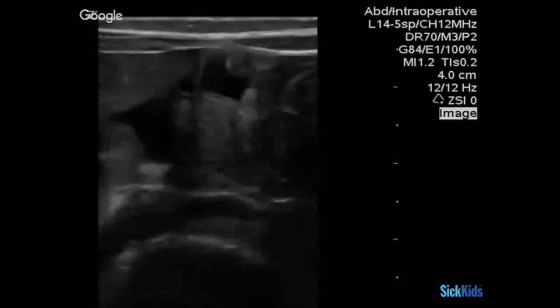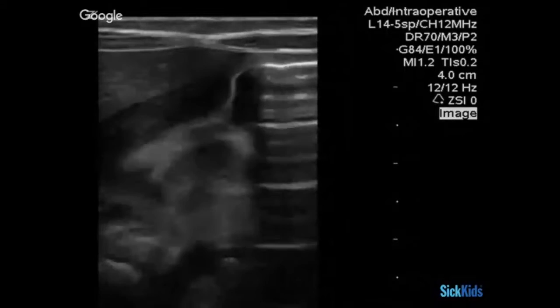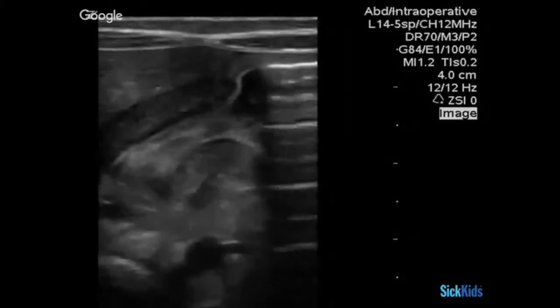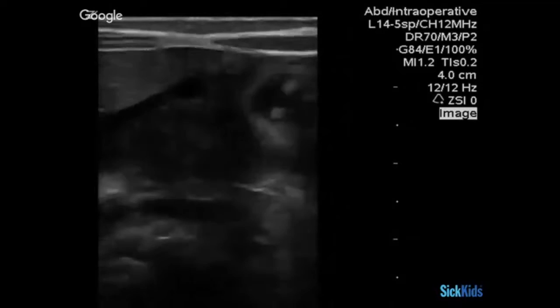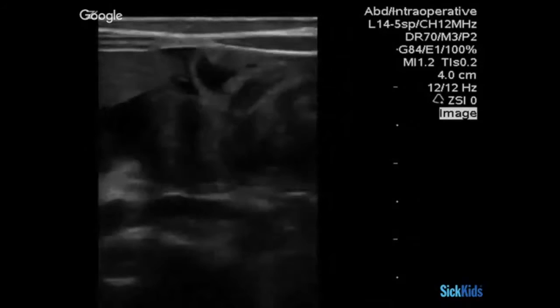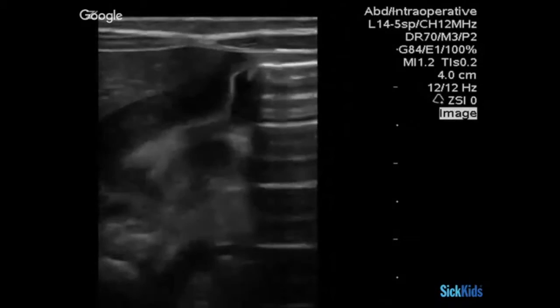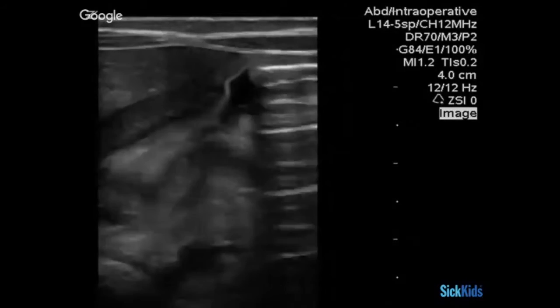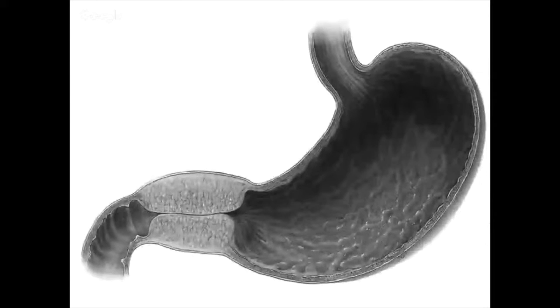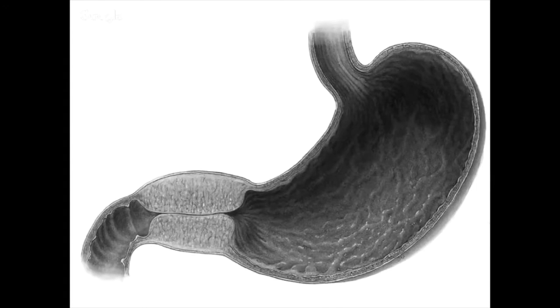The pylorus should be adjacent to the gallbladder, so mid-epigastric region. You want to capture the measurements — it's kind of sub-xiphoid. Your probe is near the gallbladder, which is by the liver edge. You can find the hypoechoic outline of the stomach and from that trace it to the pylorus. Here in this image you can see the liver, the stomach border, and then trace it down to the pylorus. This is a representation of hypertrophic pyloric stenosis showing where those walls are thickened and becoming obstructive.